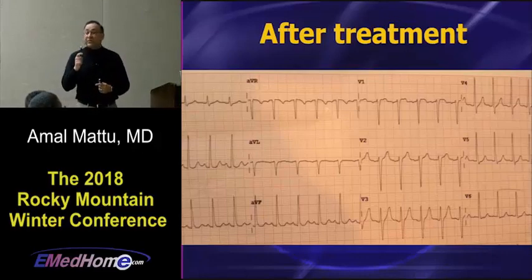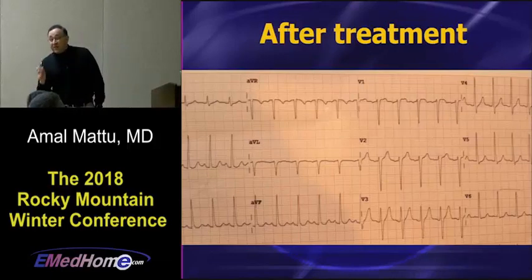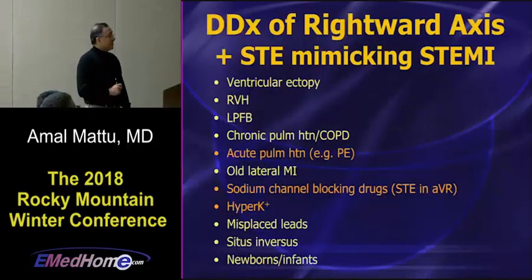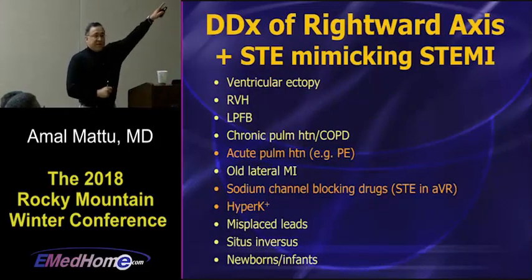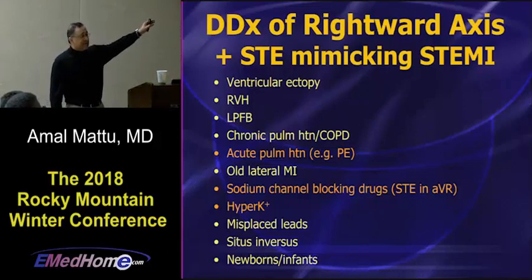In fact, I'll bet you if you look in Tintinalli and Rosen and many of the major internal medicine books, there's nothing about it in there. If you look in the electrocardiography books, it's in there, all right? ST elevation. So once again, here's our differential for things that produce rightward axis with ST elevation.